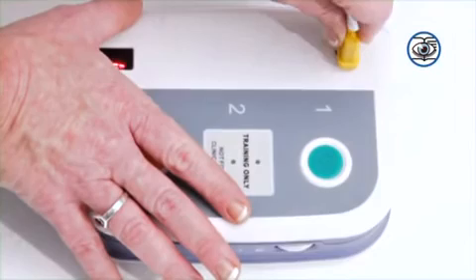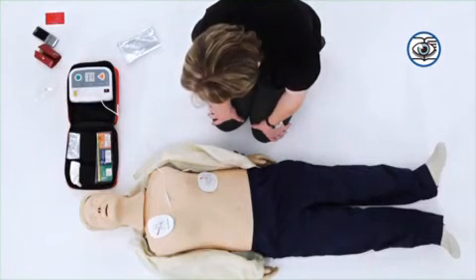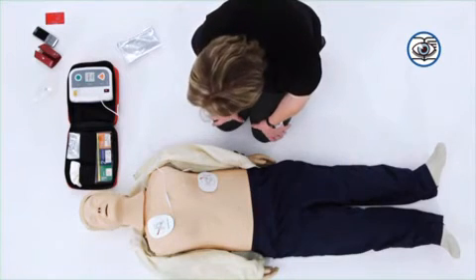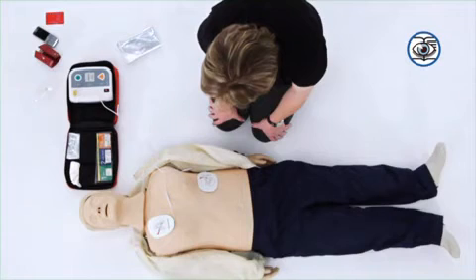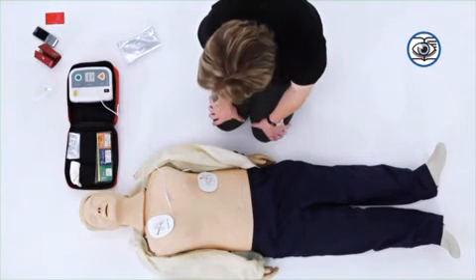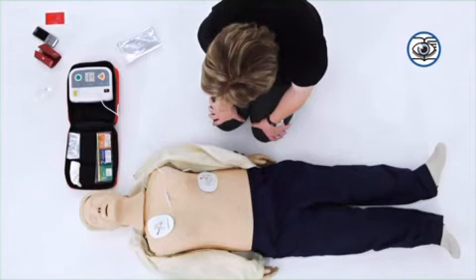After placement of the pads, the AED will automatically analyze the heart rhythm or ask you to press a button to analyze. Analyzing heart rhythm. Do not touch the patient. If a shock is indicated, ensure that everybody is clear of the patient. Shout, "Stand clear." Shock advised.